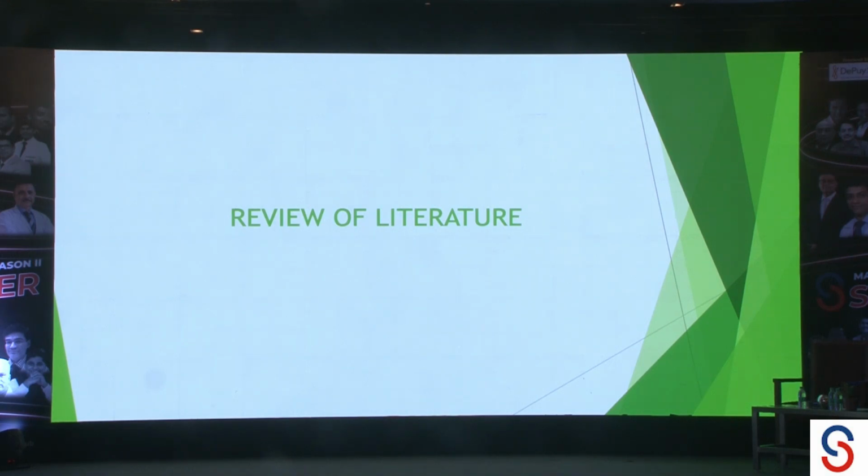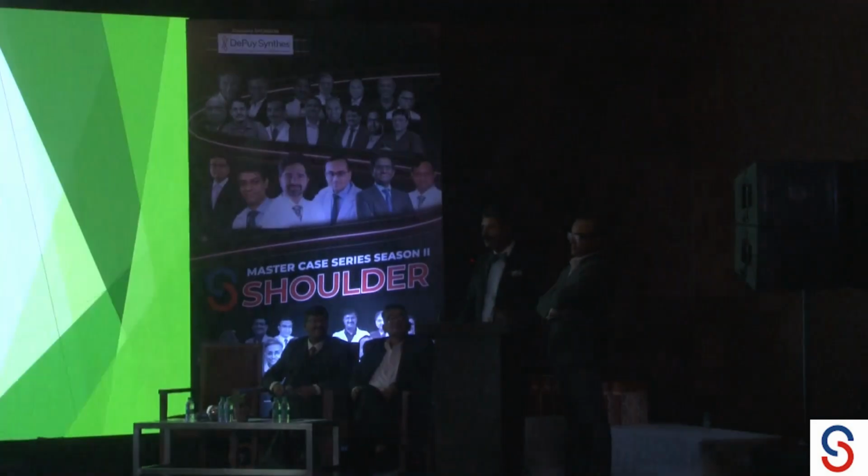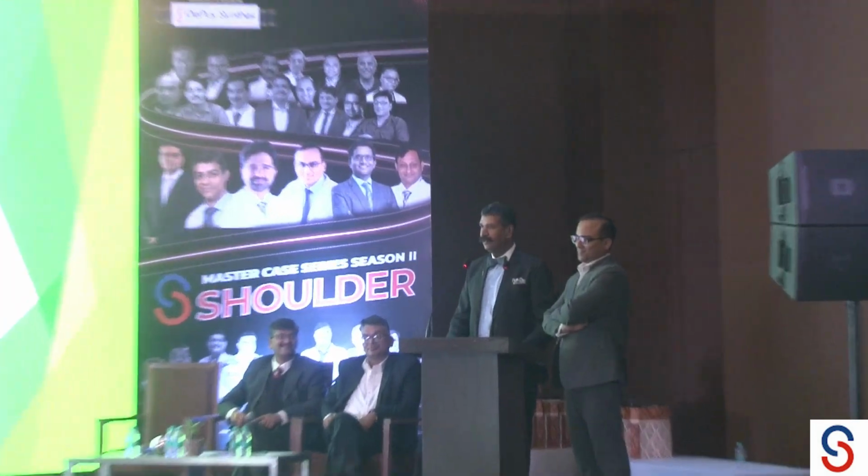So I remember reading an editorial by Dr. Chitranjan Ranawat in JBJS. He was speaking on total hip replacement, and the title of the editorial was "The Legs Too Long and the Pants Too Short." And I think with increasing humeral head heights, we are going to see the upper limb variant of it: the sleeves too short and the arms too long. So I think that is something we must be prepared to see. Upper arm asymmetry, of course, is less visible than lower limb asymmetry. True. But what is the acceptable level of arm lengthening?